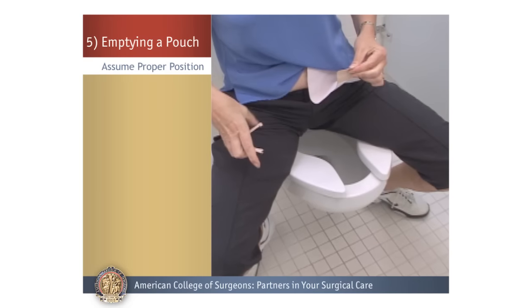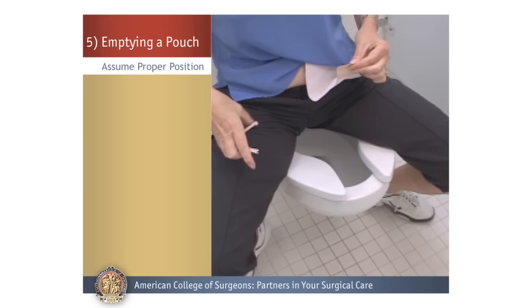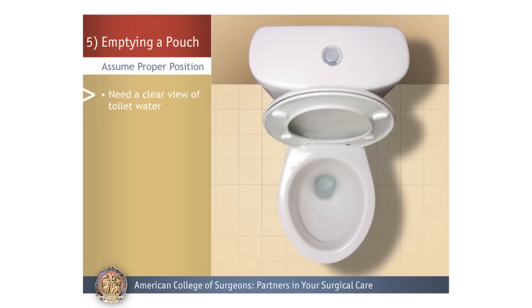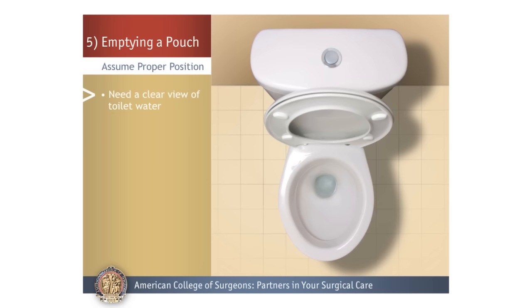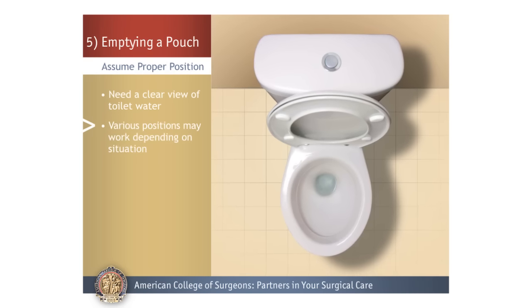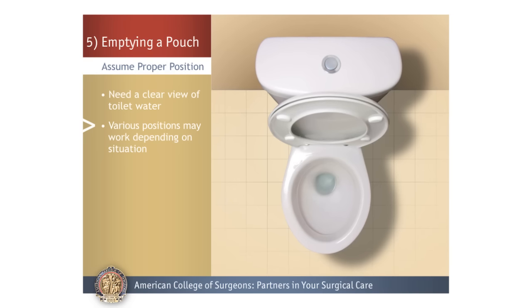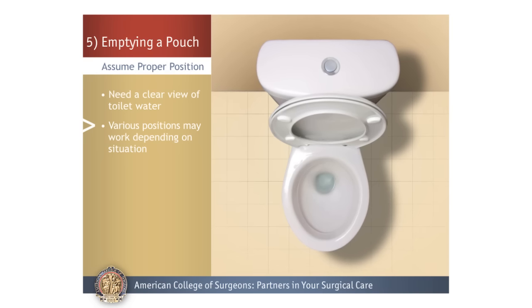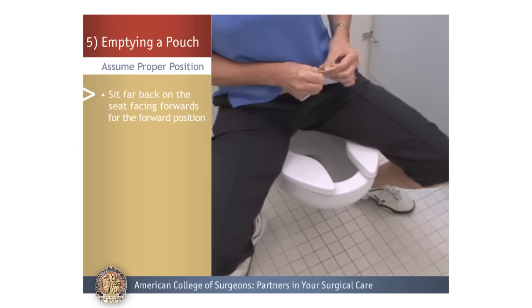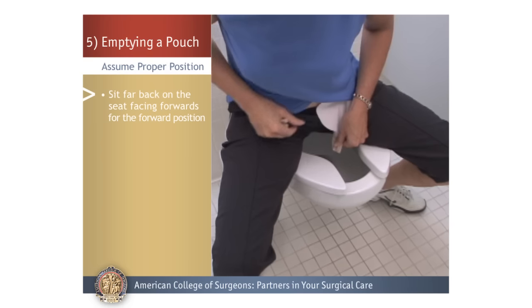Assume proper position. To empty your pouch, you'll need to have a clear view of the water in your toilet to ensure you have enough space to empty the pouch and avoid soiling your clothes. There are a number of possible positions that may work depending on your size, the layout of your bathroom, and your general comfort level. For the forward position, sit far back on the seat, facing forward.